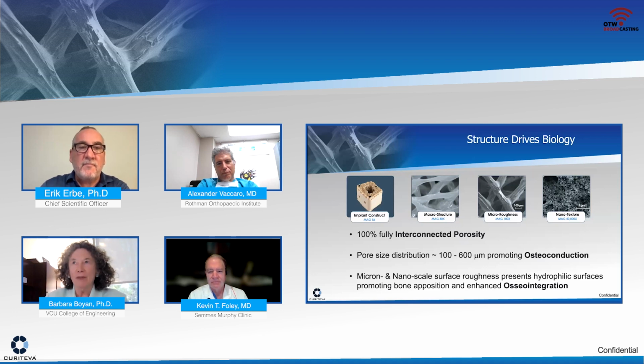Many of you remember the mesenchymal stem cells, they can differentiate into bone forming cells, but they can just as easily differentiate into fibroblasts if they don't have an environment that supports them being an osteoblast. And an osteoblast has an insane need for oxygen. So what I thought as I looked at this new structure was that there are no dead ends. There's no reason, particularly when you realize all that VEGF is being produced, there's no reason for the vasculature not to grow all the way through.